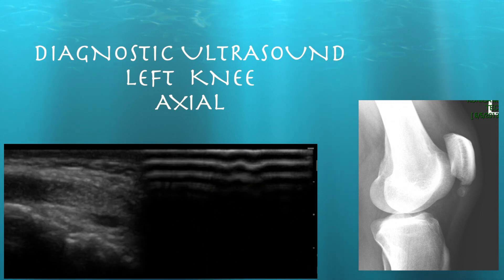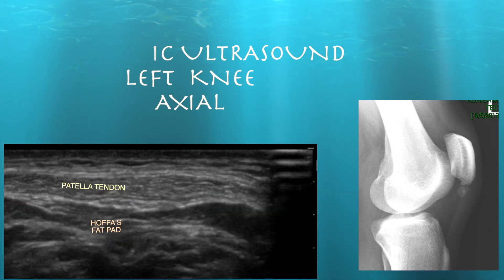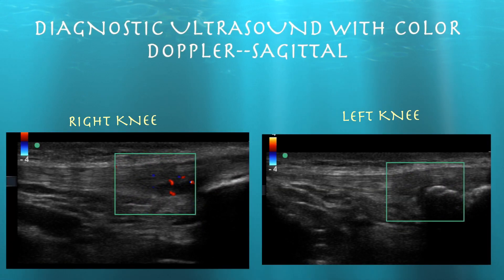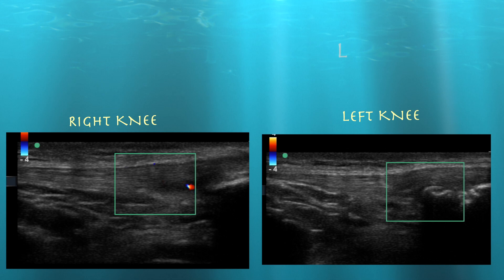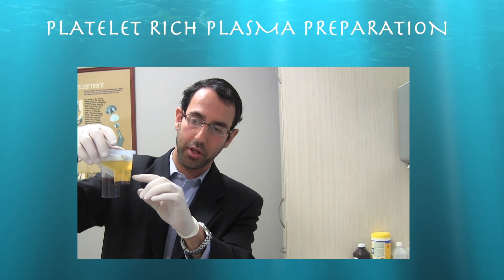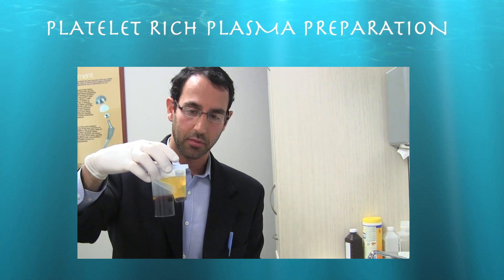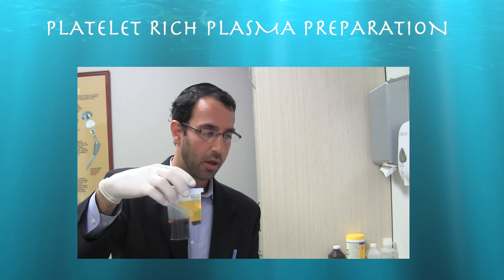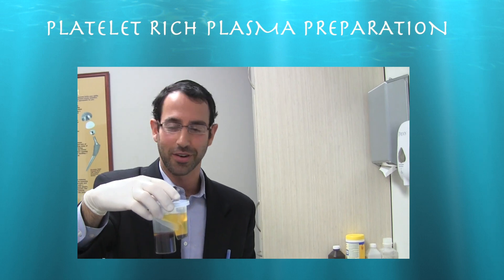Looking at the patella tendon going distally, his right knee does show increased signal within the proximal patella tendon. Here is our patient's PRP — here is the platelet sediment, this is platelet-poor plasma, and this is blood that we're going to discard as we prep it. He's a 23-year-old male with bilateral patella tendinosis; the proximal third of his patella tendon is pretty severe. He may have had Sinding-Larsen-Johansson syndrome when he was younger, based on the appearance of his left knee.